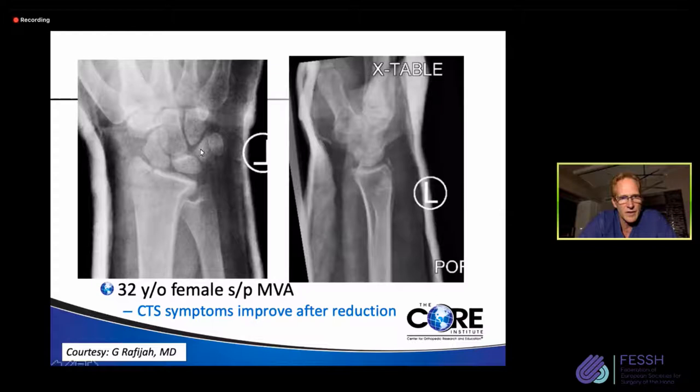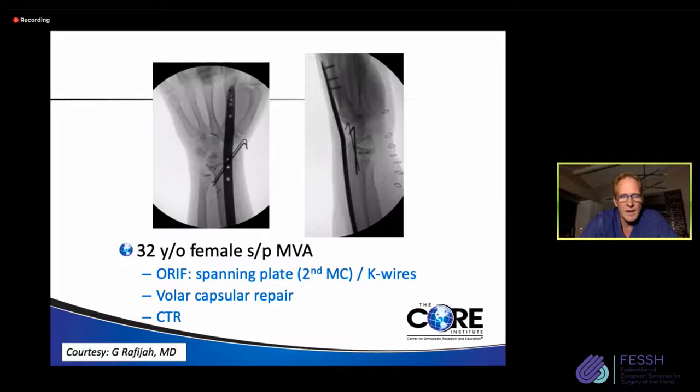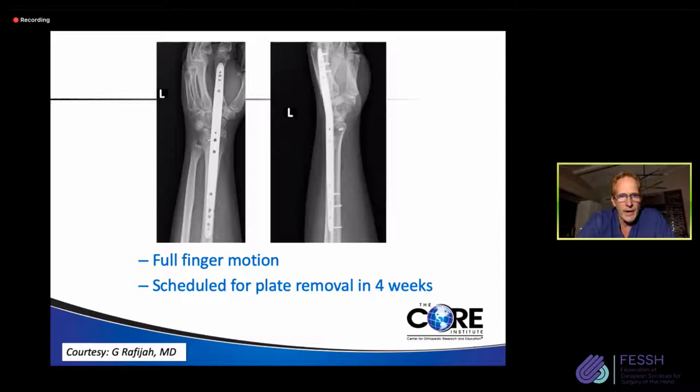There are certainly different ways to fix this, but he decided to span it, fix the radial styloid with pins and use some suture anchors for the capsular repair, as well as a carpal tunnel release. Now he spanned to the second metacarpal because that was his preference and he felt that was all that was needed. He didn't need to go to the third. He's telling us that the patient has full finger motion and he plans to remove this plate in about 4 weeks.